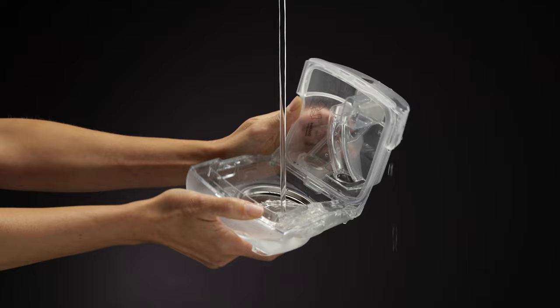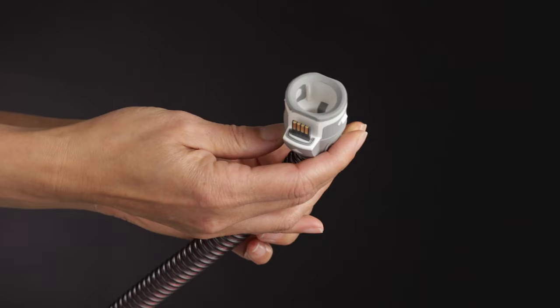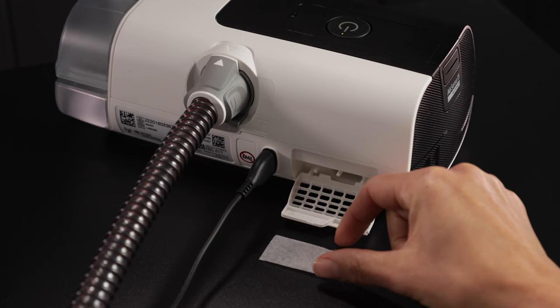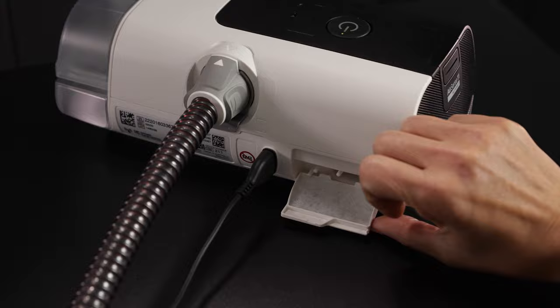Rinse with clean water. Check the air tubing and replace it if there's any holes, tears, or cracks. Check the air filter and replace it every 6 months. Replace it more often if there are any holes or blockages by dirt or dust.